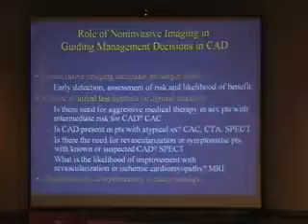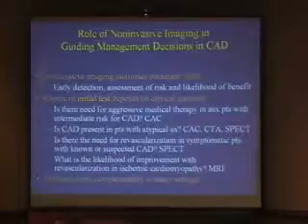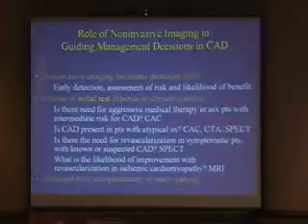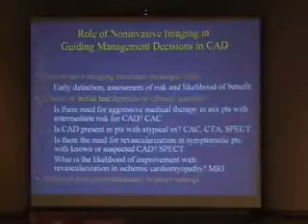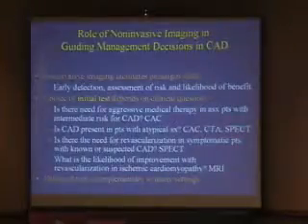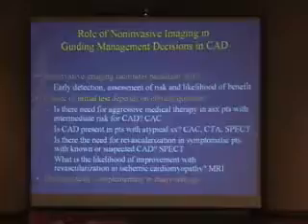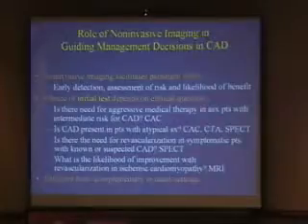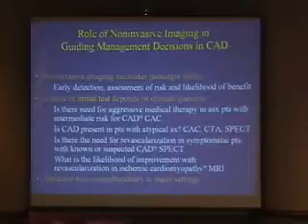In a patient with either coronary disease or suspected coronary disease based on symptoms, where the question is this symptomatic stenotic disease that might be associated with ischemia, then it might be coronary calcium, but maybe you'd be starting either with a coronary CT angiogram or with a SPECT study. If the question is is there a need for revascularization and you're trying to define benefit, probably defining ischemia makes sense. And in an area we didn't talk about tonight, at the other end of the spectrum, patients with heart infarcts, you're trying to decide should they be revascularized or have a ventricular reshaping, then viability testing is important, and MRI probably plays a strong role there.